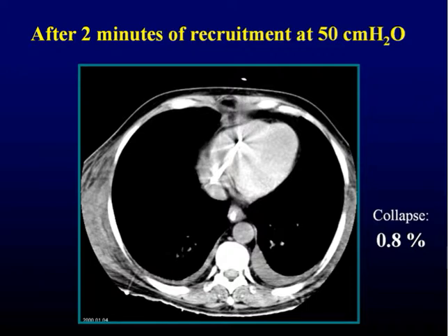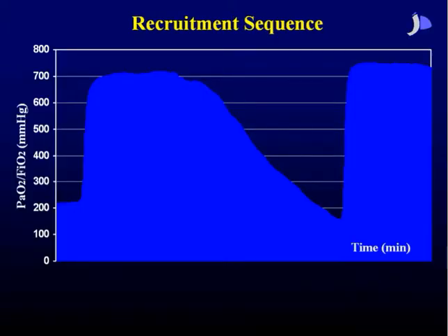So let's see how a clinical protocol works, still using oxygenation as the reference. The background is the oxygenation measured by a continuous online blood gas monitoring. And our clinical protocol goes for patients with acute lung injury. In the first phase, we determine the baseline ventilation. These are the ventilation pressures, 28 over 10.